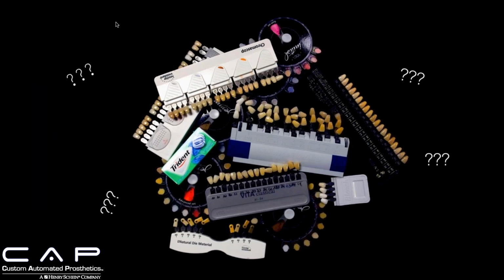So here is about half of what I have in my drawer for shade taking. It's a little overwhelming sometimes. It's hard to look at a tooth in the mouth and say, that's definitely an A3.5 or a 210 Chromascop shade or whatever. Sometimes we have to use our best judgment, and we have to skip around from shade guide to shade guide.